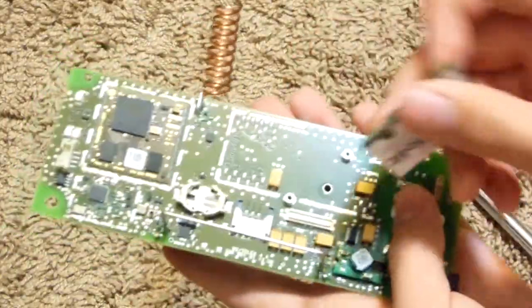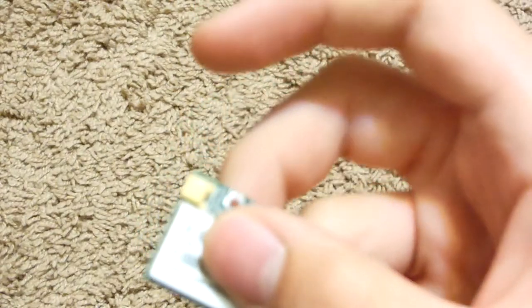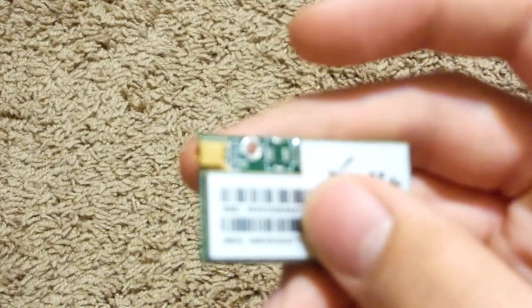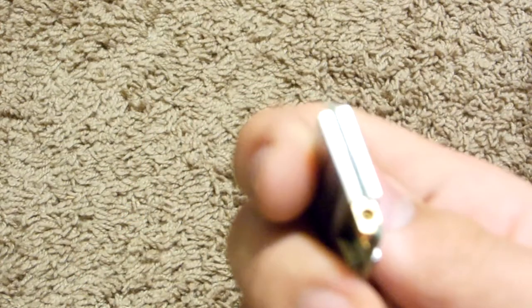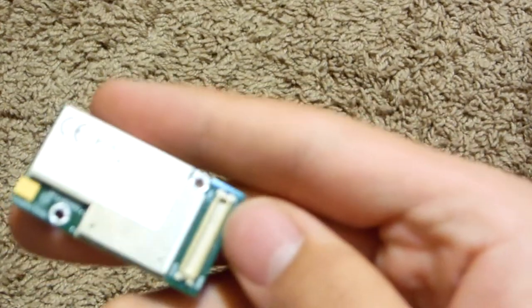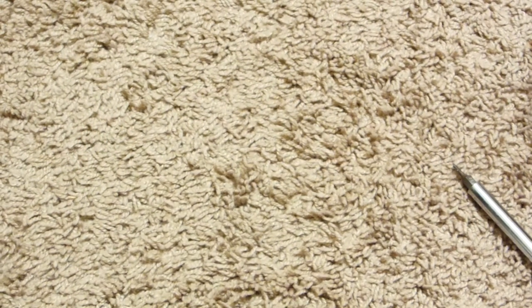Just pop this out. And there's a nice gold-plated connector there. The thing itself isn't really gold-plated. However, there's another nice connector there as well. Let's go ahead and pull off this cover.